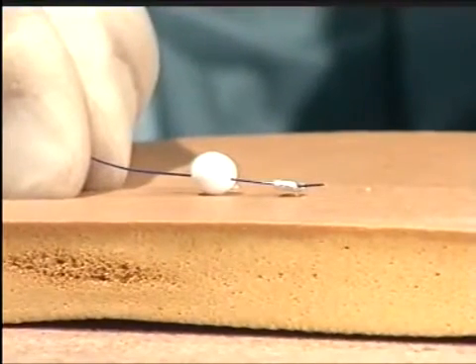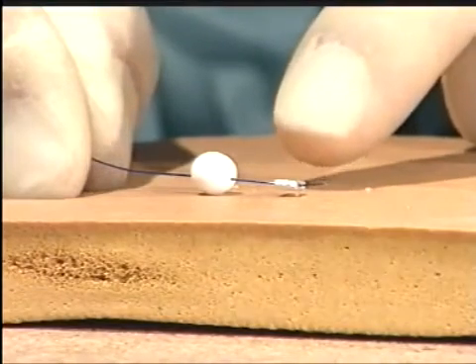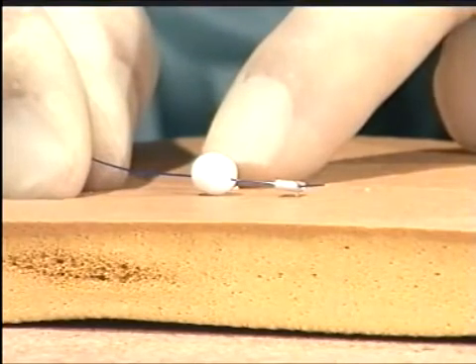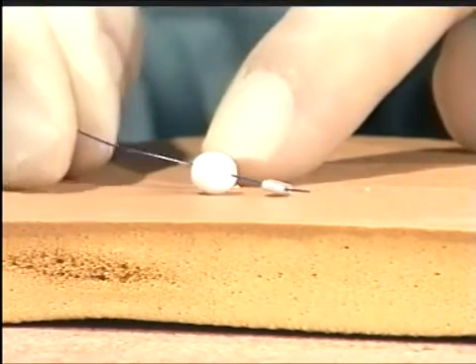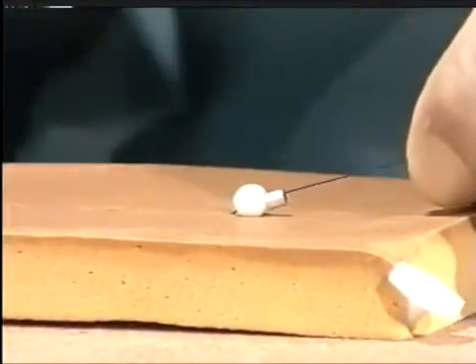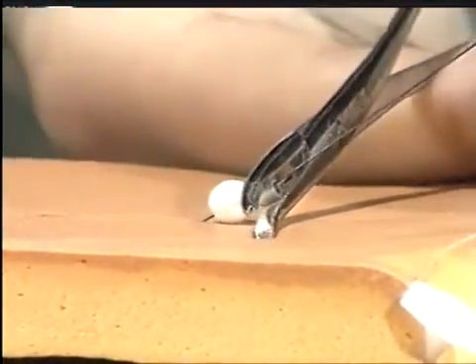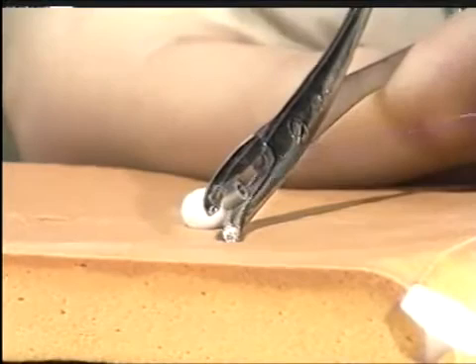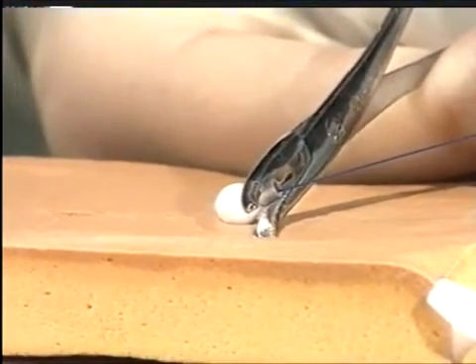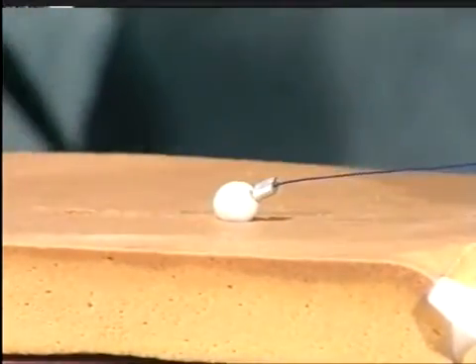For non-absorbable sutures, some surgeons like to use the collar and cuff technique. There is a crushed bead at one end, followed by a larger bead to stop the suture being pulled through the needle hole. Once the closure has been completed, a further bead and cuff are placed onto the suture end, and once the correct tension has been applied to the suture material, the metal bead is crushed using a substantial hemostat or bead crusher. Then the suture is cut.